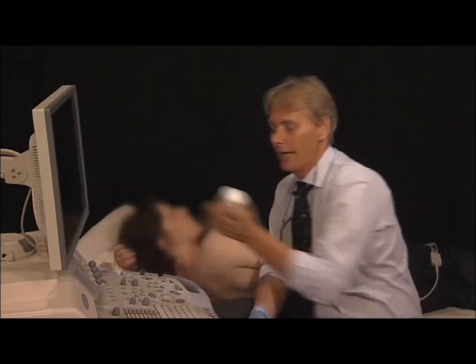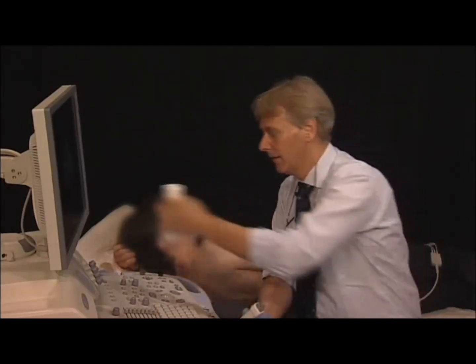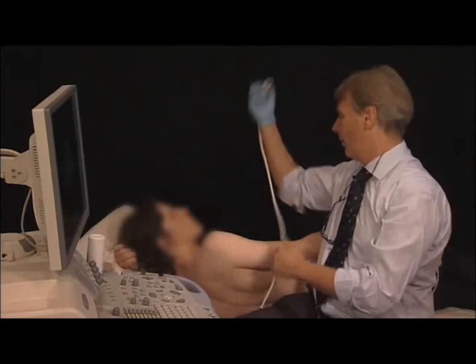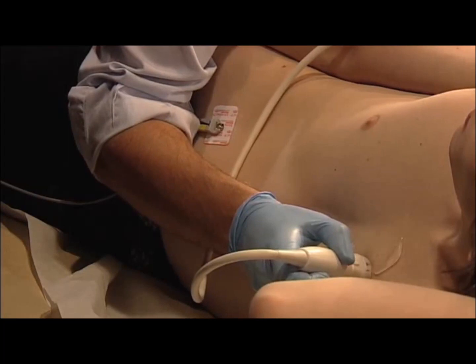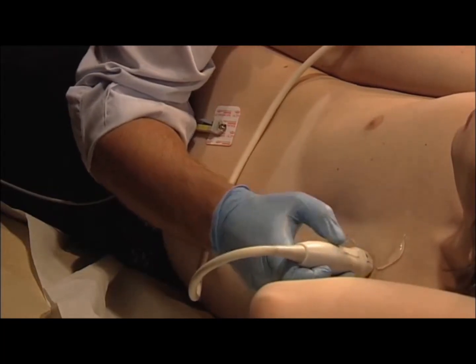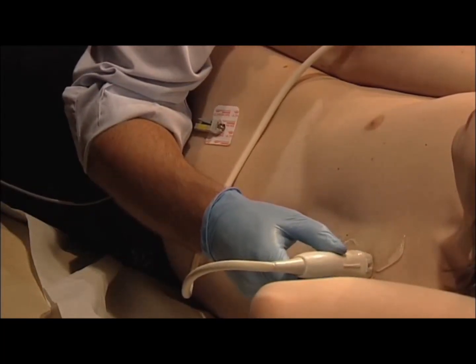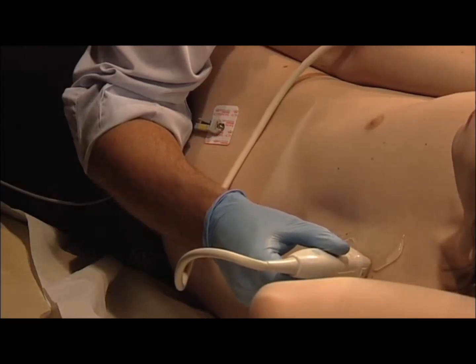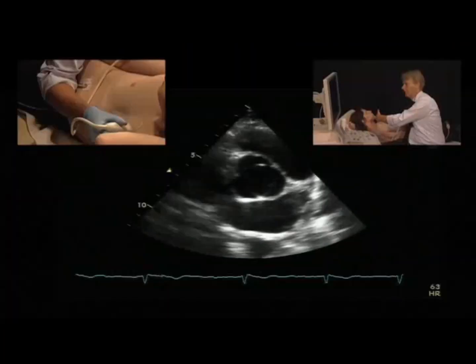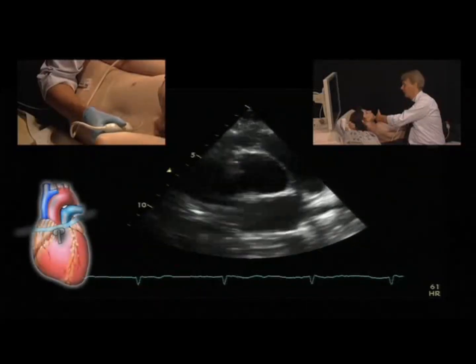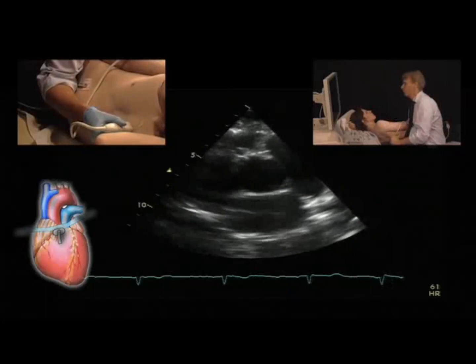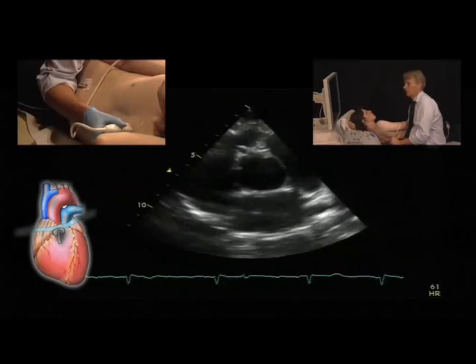The parasternal short axis is in a 90-degree orientation to the long axis. If you remember, the marker was pointing towards the right shoulder for the long axis. Now we rotate the transducer clockwise until we are perpendicular to the original plane. Now the marker is pointing towards the left shoulder, or armpit actually.